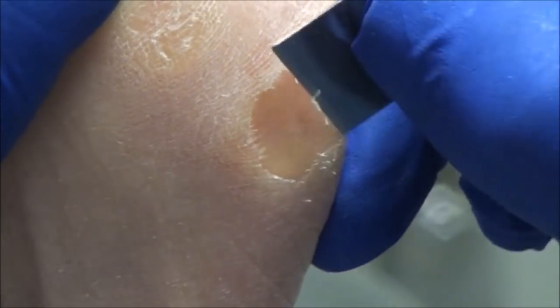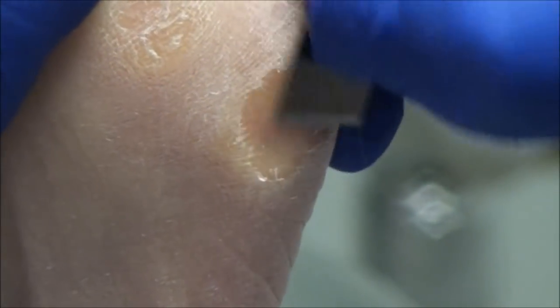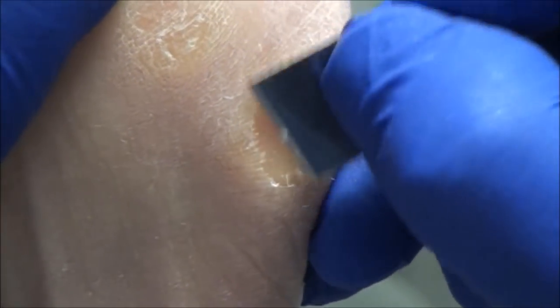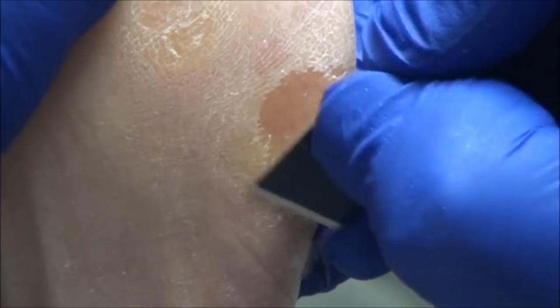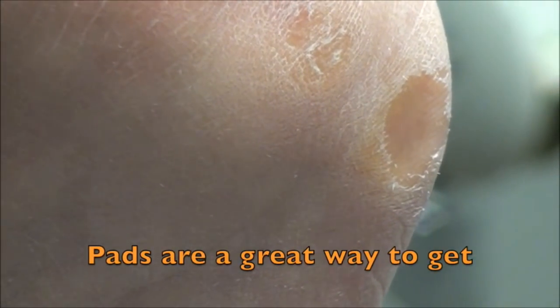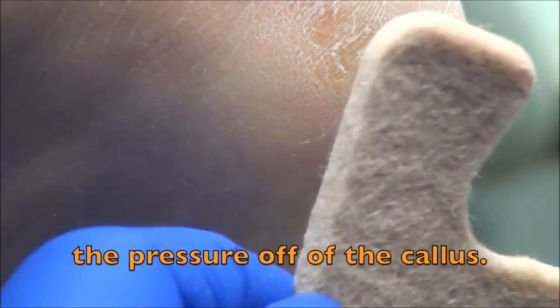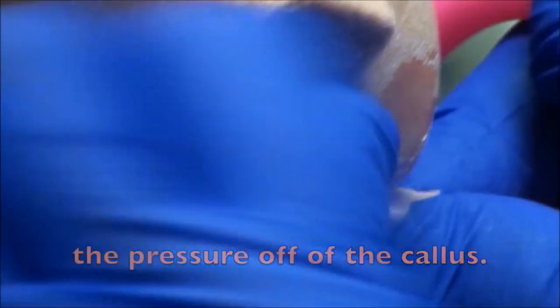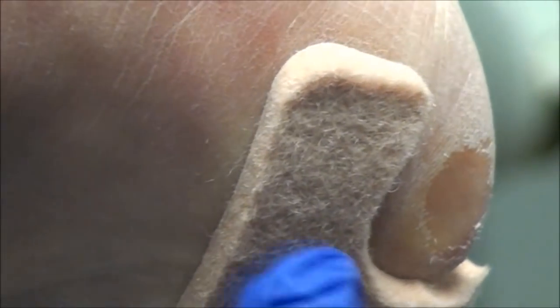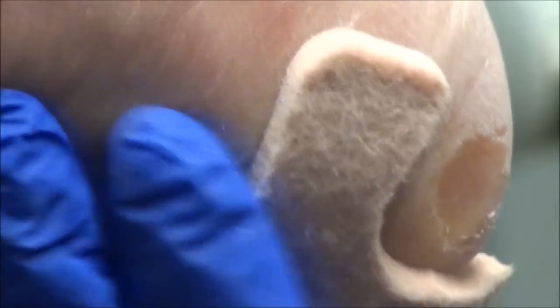Okay. Well, let's take a look, and sometimes if we can put a pad around this, I'll show you what I'm talking about, and we can either put it on your foot or in the shoe, then we can help keep it from coming back so quickly. So these are just some adhesive felt pads that go like this. Clever. It'll take up the pressure around it and help keep the pressure from the ground off that spot.